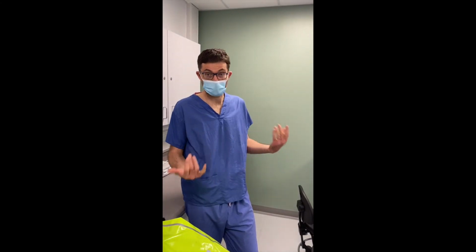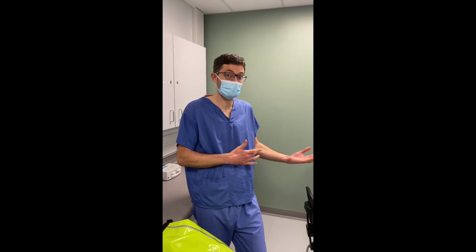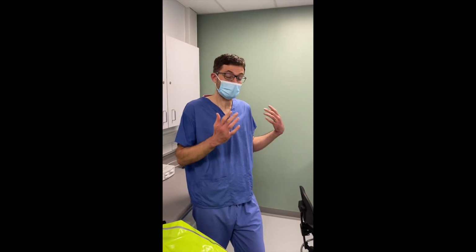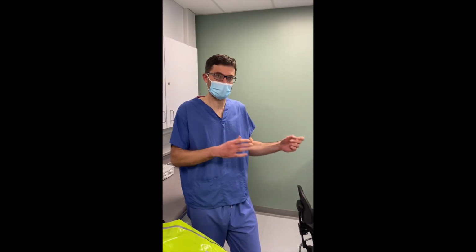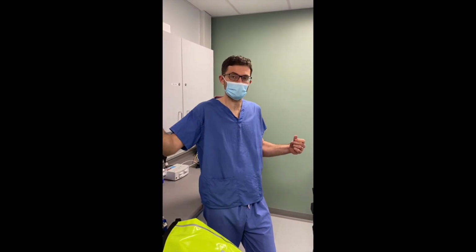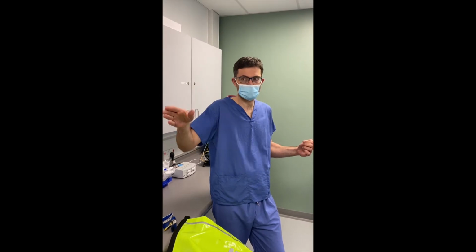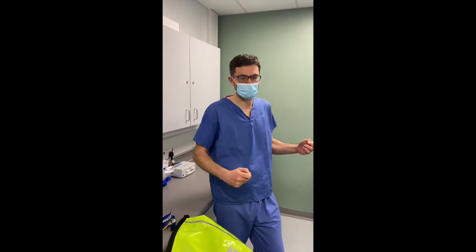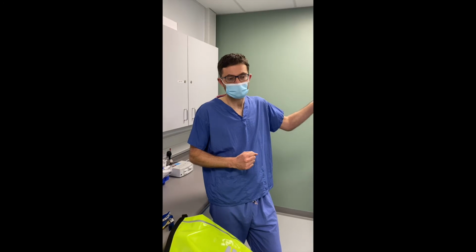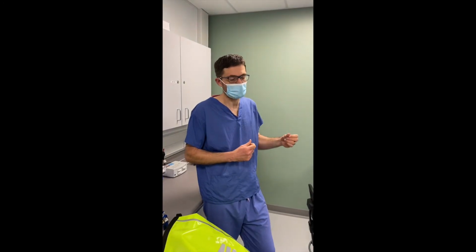Down, you need to ensure that you've got all your drugs and pumps and infusions drawn up as per the SOP. So you need 2 sets of drugs or infusions that the patient is on, because one set will be run from the control room through the holes in the wall, which we'll show you later in the video, through to the patient, and will be under the control of the clean doctor.